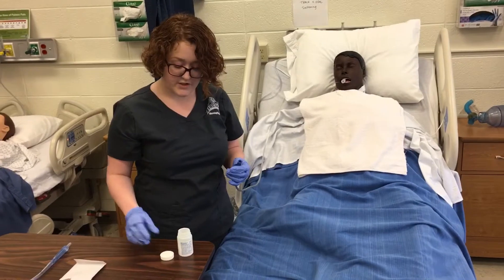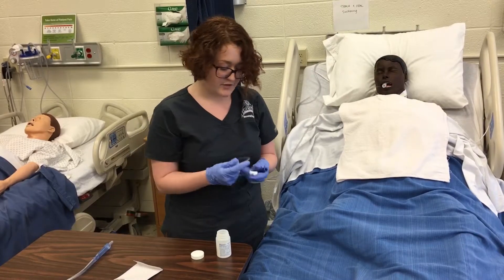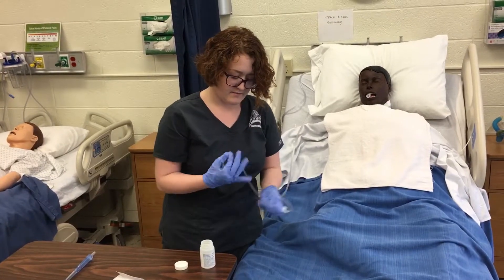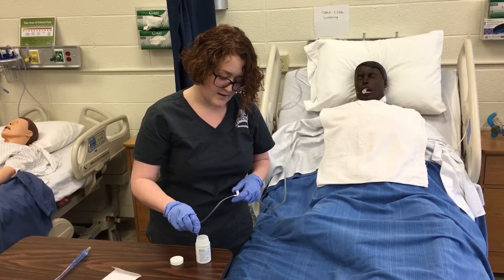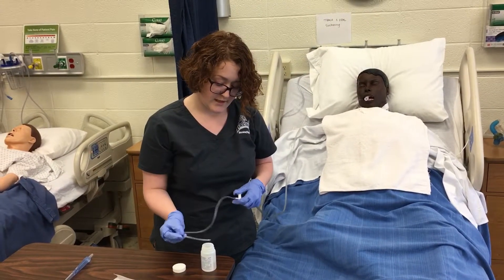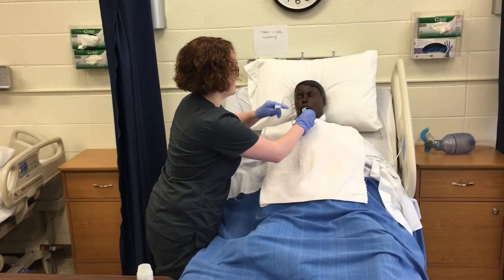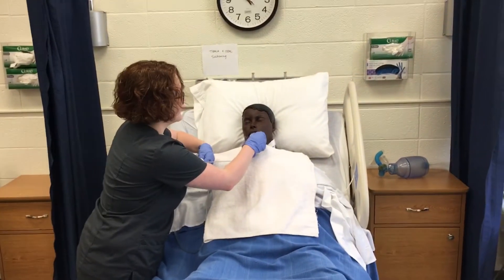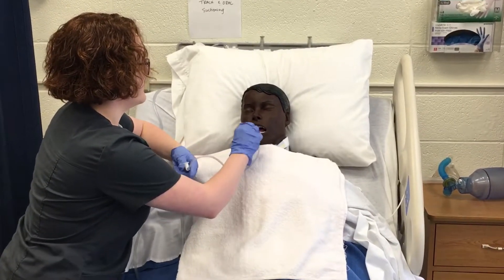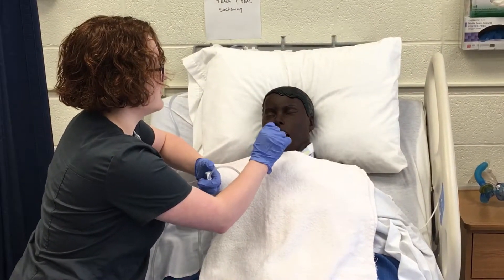For oropharyngeal suctioning I'm going to need a catheter. I would have new gloves for this procedure. I'm going to attach it, then lubricate the tip. I can pull some of the lubricant up, some of the water up, and make sure it's working right. Then I'm going to insert down to the oropharynx about three to four inches and apply intermittent suctioning as I'm pulling back. Insert again three to four inches — intermittent suctioning as I pull out, not as you're going in.